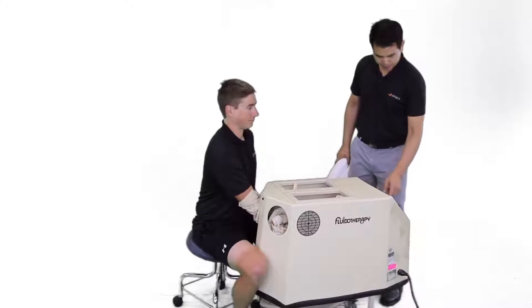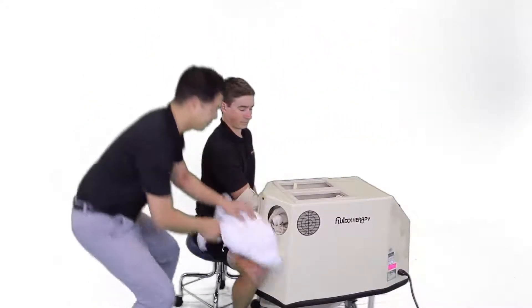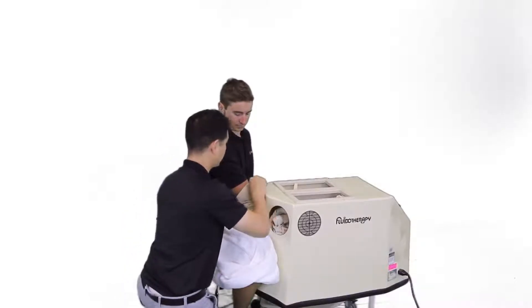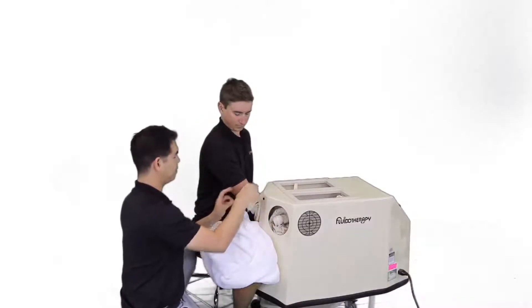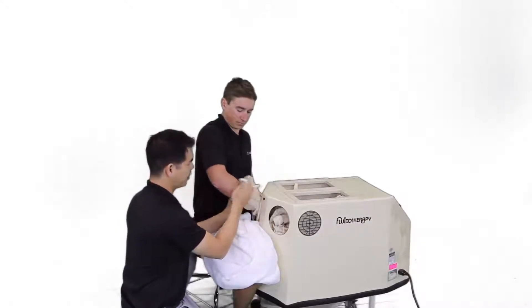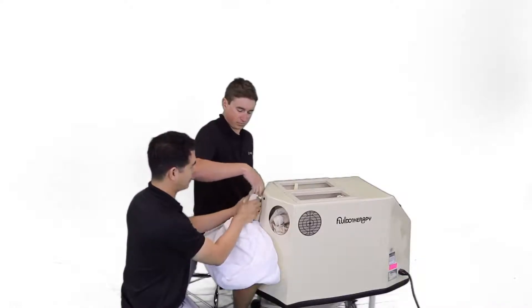When the treatment is complete, we're going to come around, remove the sleeve, and gently brush the leftover husk back into the Fluido device.